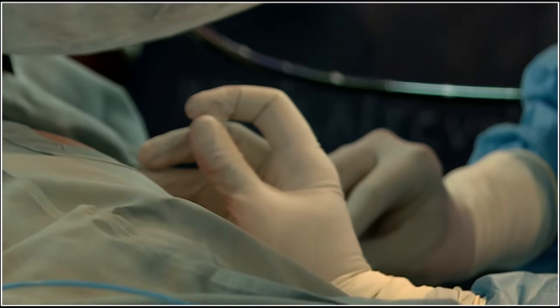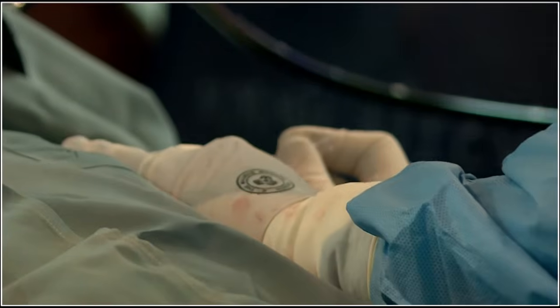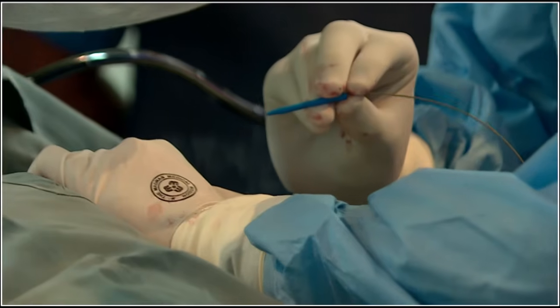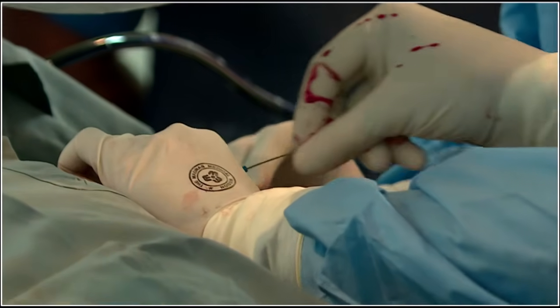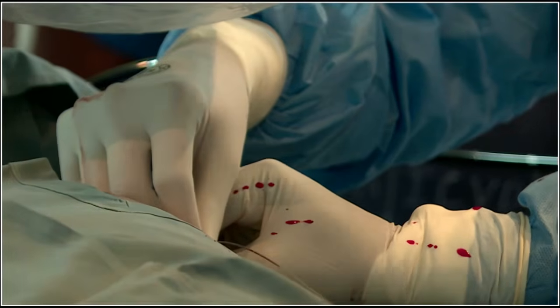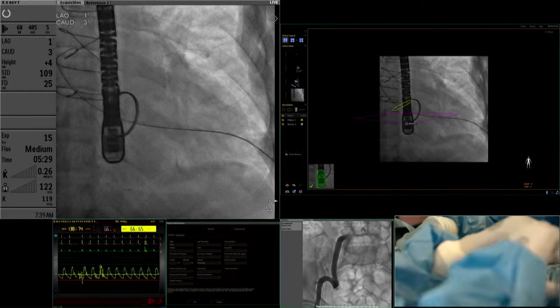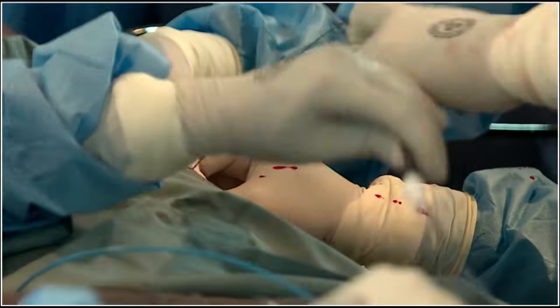So the marker has already been made. This is my needle, and we are palpating the apex, and I am going inside, and the moment I get the apex. Are you worried about the LAD, distal LAD? Basically, the last parts of the LAD are tough to identify. The coronary angiogram is not going to effectively show all the last terminal diagonal branches, so it has not been our practice, except during the initial diagnostic angiogram, to have a parallel LAD injection.